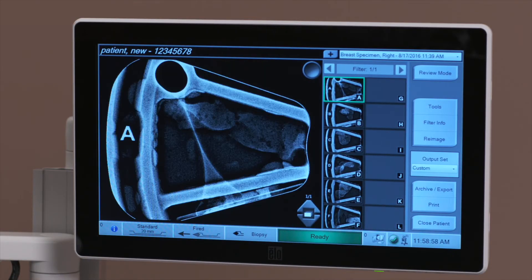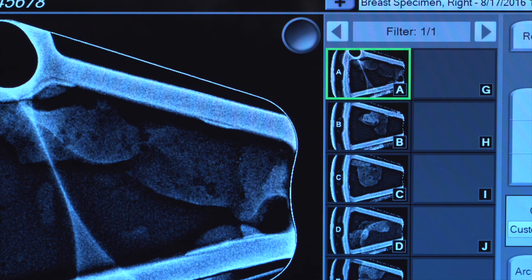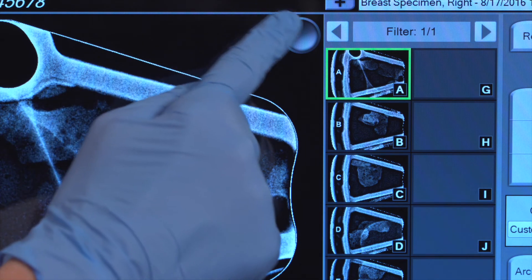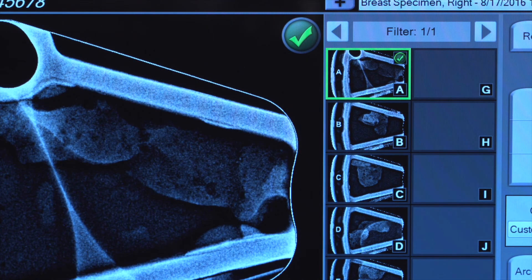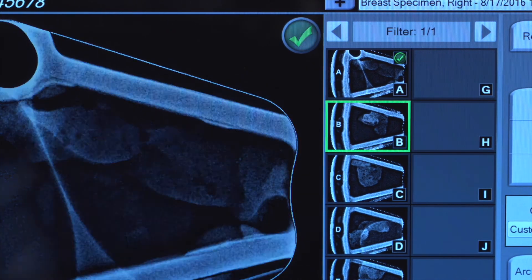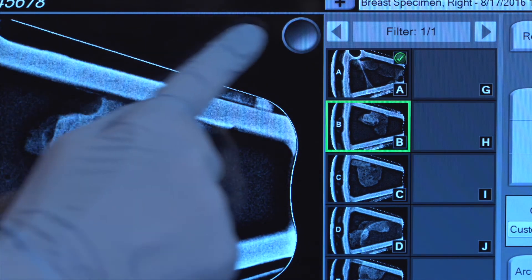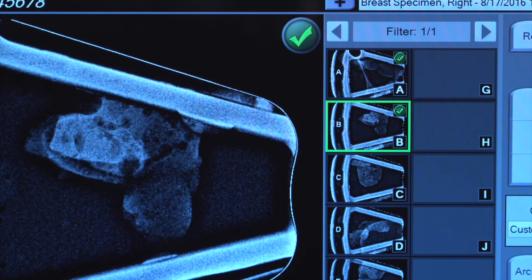While reviewing the images, the physician may want to tag the samples with calcifications. To do this, tap on the large circle in the upper right corner of the filter image. A large green check will appear when the image is tagged. To untag, simply tap on the circle a second time.